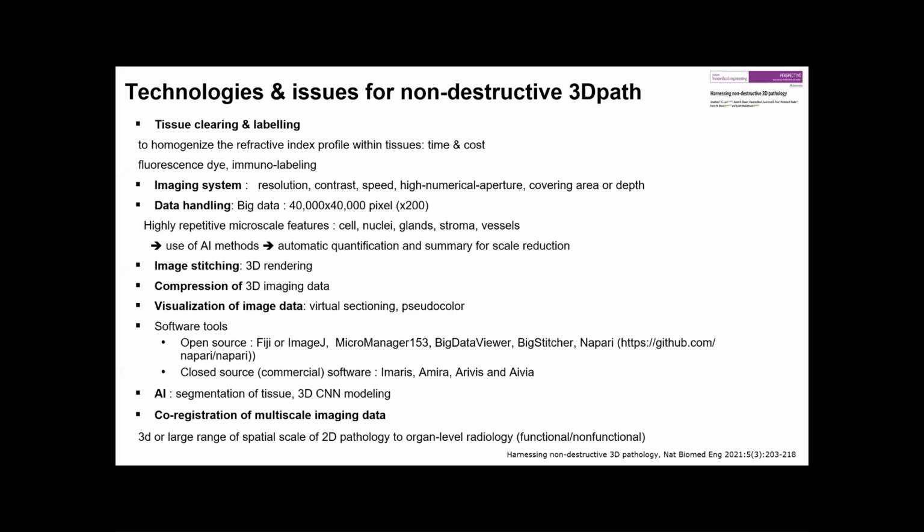3D rendering and pseudo-color are the main algorithms for virtual sectioning and for pathologist interpretation. Some free algorithms and commercial software are introduced. Recent AI algorithms using convolutional neural networks and generative AI are used for this field.